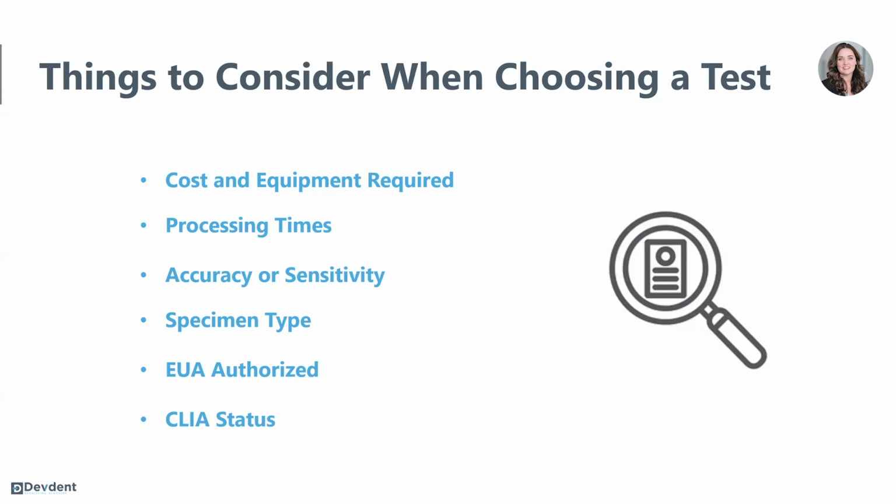So what are some things to consider when you're choosing which antigen test you may want to use?